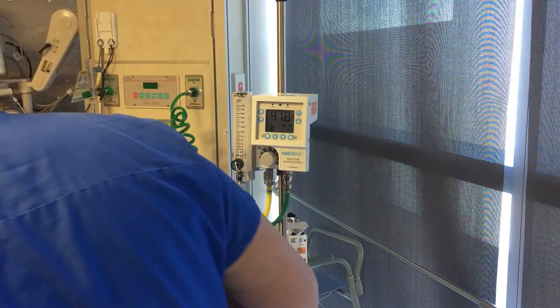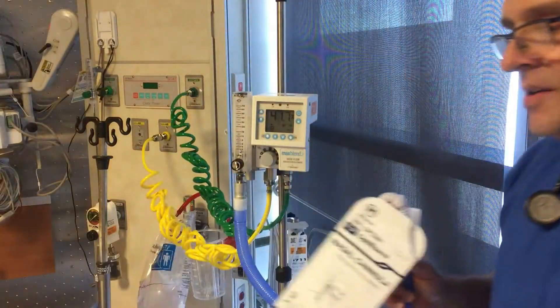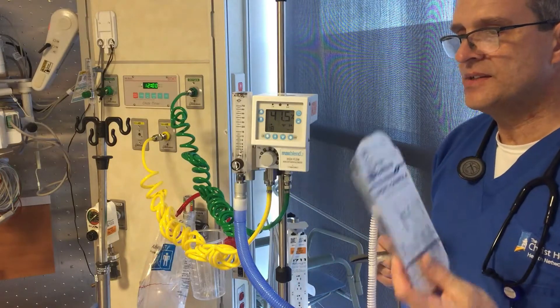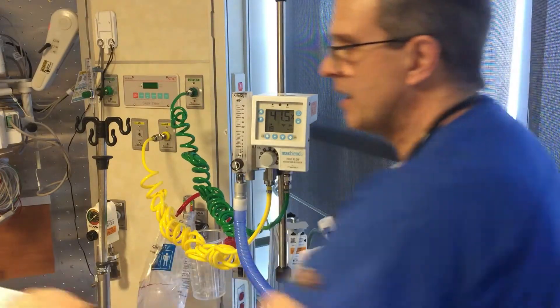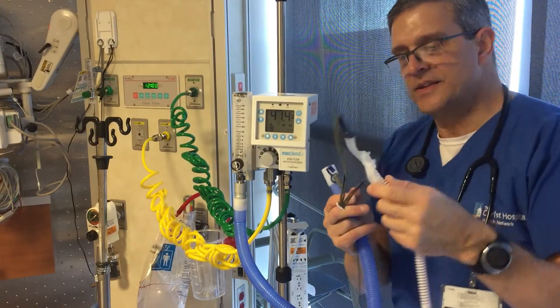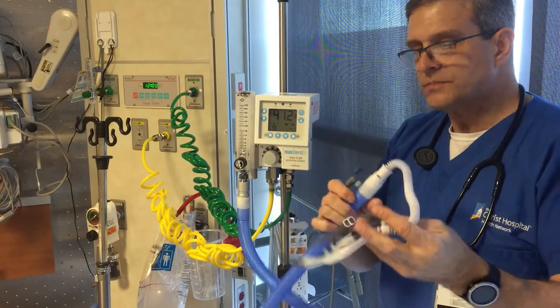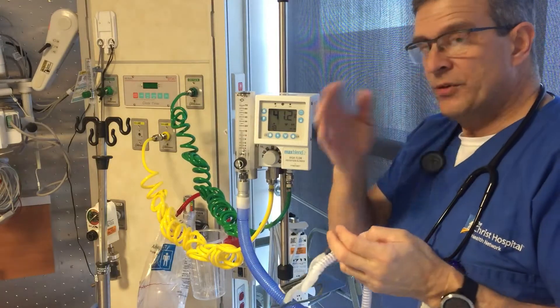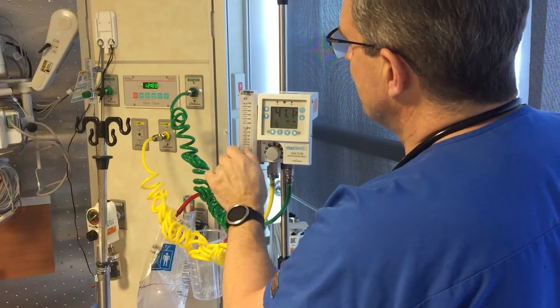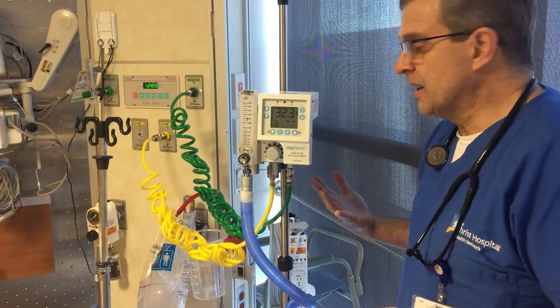Now we're ready to connect the system. I have medium prongs — they come in different sizes. Medium is good for a lot of people. They do have sizing charts or you can just eyeball it. You basically want the prongs to be the same width as the nares on your patient. We always turn things on before we put them on people's faces. I'm going to start out at 30 liters a minute, which is a pretty decent liter flow, of course depending on the patient's needs.